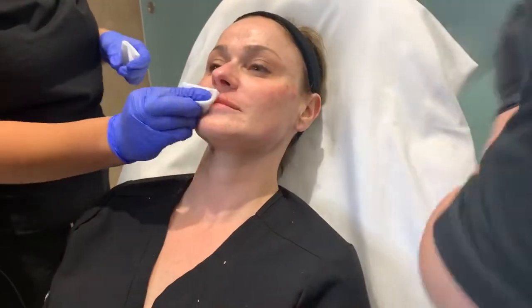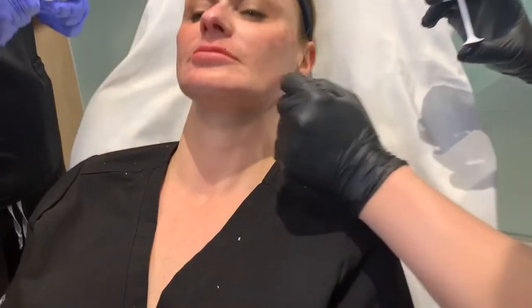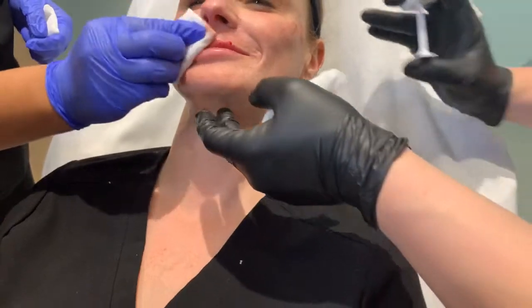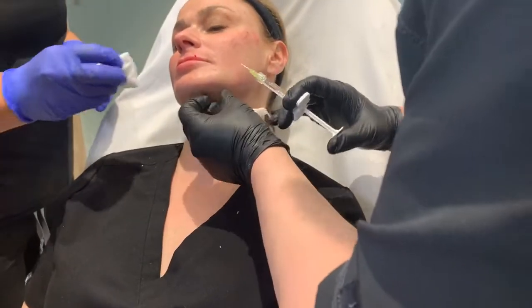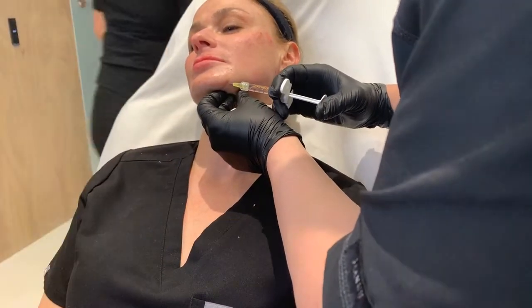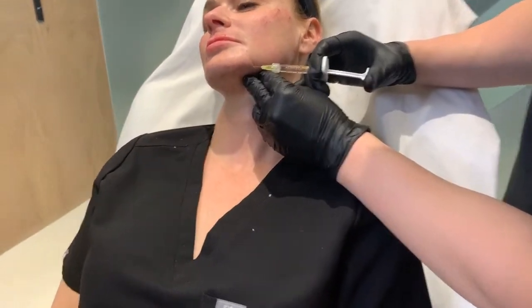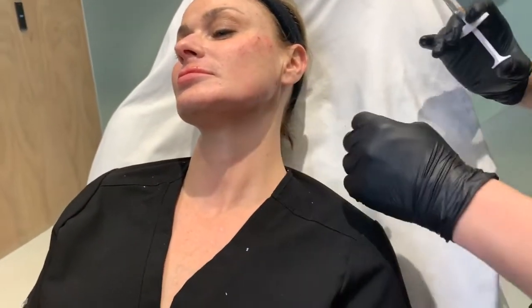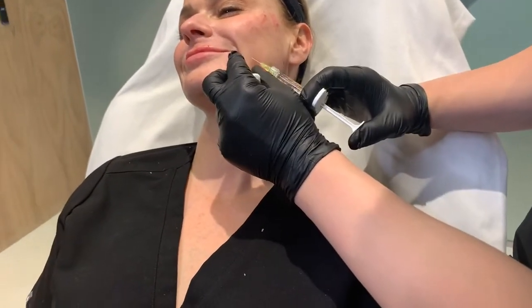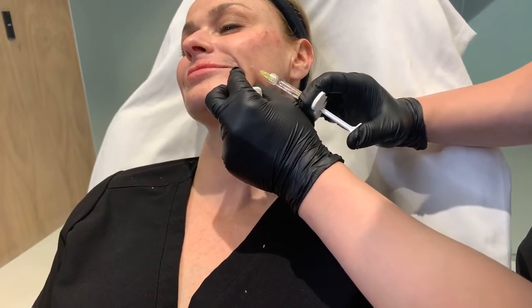So let's show her this. Wait, actually, sorry, let me do one more thing. We're gonna do number 9. A little thing, these little wrinkles right here. Smile again, in this area. So we're gonna improve those a little bit by using a fine filler. Also, I wanna just soften the edge of this marionette. So we just inject very superficially right there and kind of cover up that little indent. There we go. Now smile. See these fine wrinkles? We just wanna do little blebs right under the skin, bilateral.